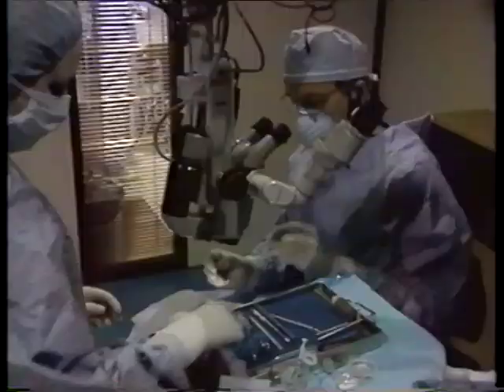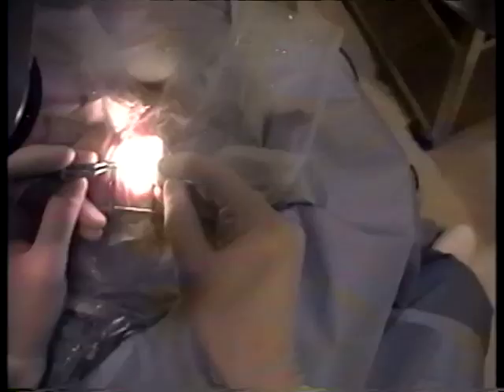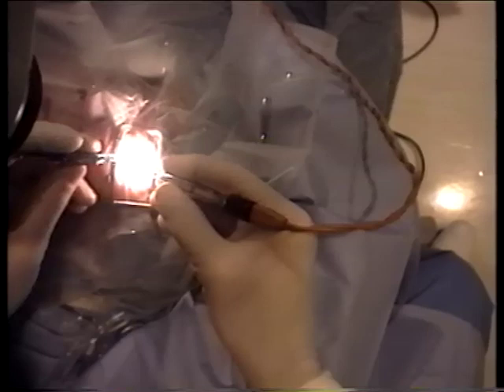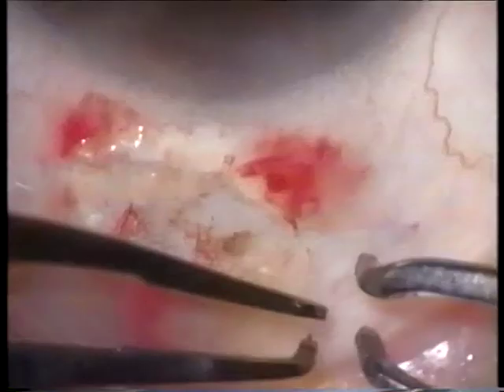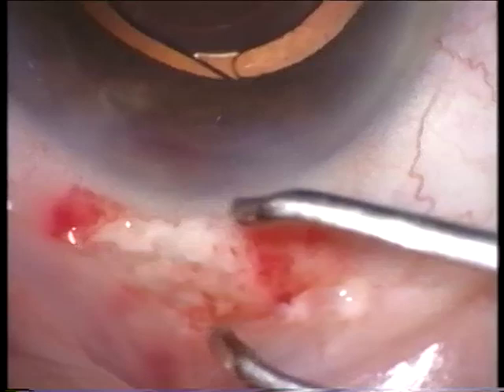Look to the right just a little. Okay, now straight ahead again. We put a little marking on the eye after the scleral incision is sealed. Irrigation free flow.